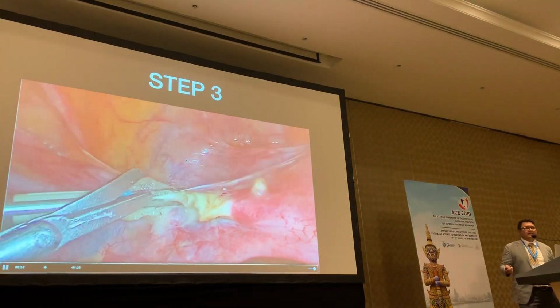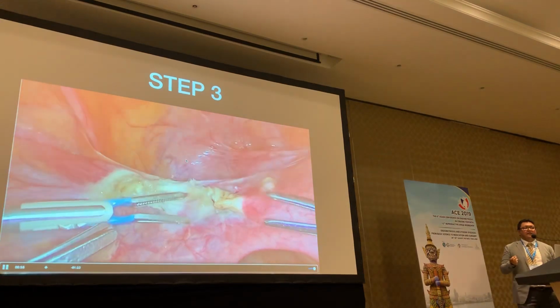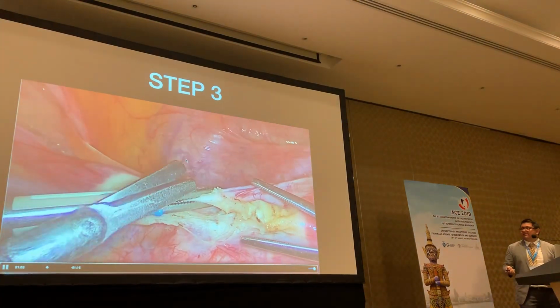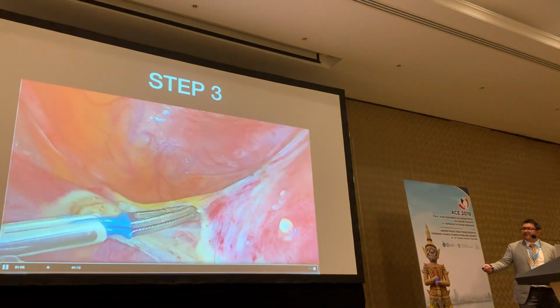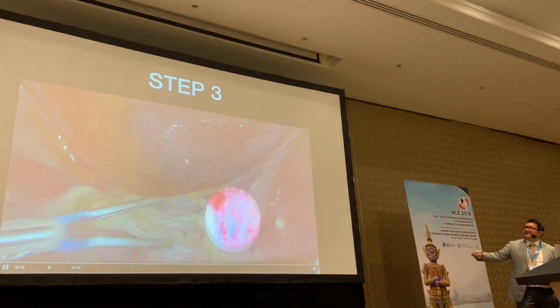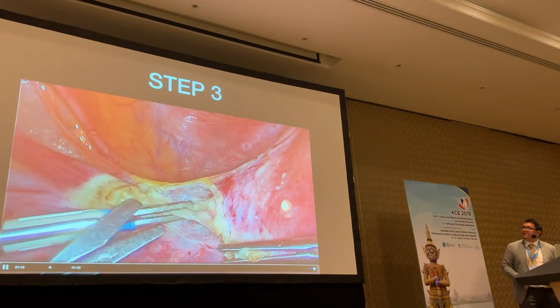So you see, most surgeons are very anal about not allowing even the capillaries to bleed. So I try to replicate that through most of the surgery. I don't allow bleeding, so I don't have to use suction. This is an important step. You can see the assistant holds the cut end and pulls down. So this highlights the road you've got to traverse during the rest of the procedure.